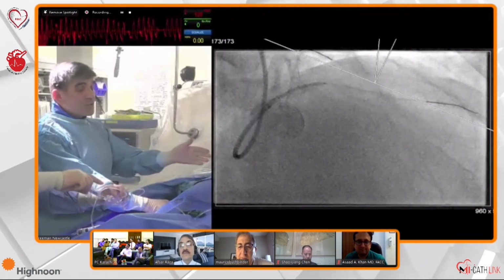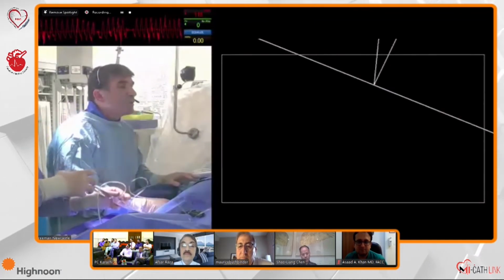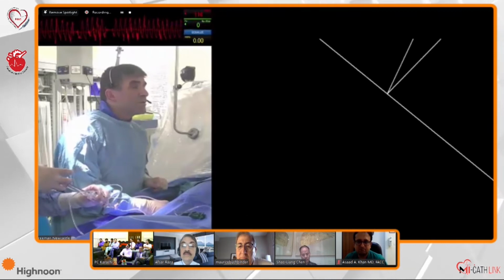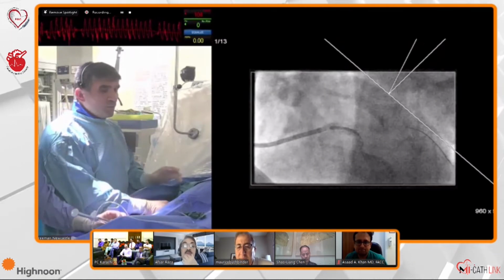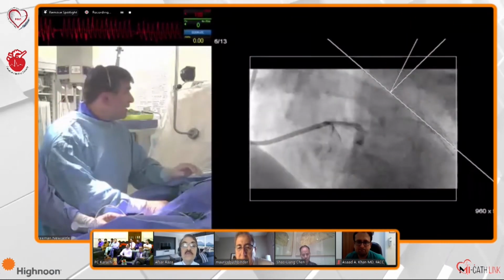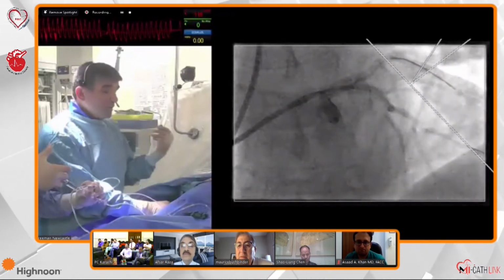Now positioning in the ostium, I could show you the technique I do, but I think we're okay here. We could see the ostium reasonably okay. I'm not too worried. Okay, test there. Okay, perfect. Just PA cranial, store that. If you notice, I hardly take cine in here. The CTO has taught us to conserve our X-ray and our dye. Perfect. Okay, go up there.